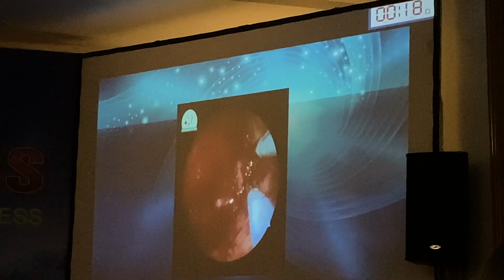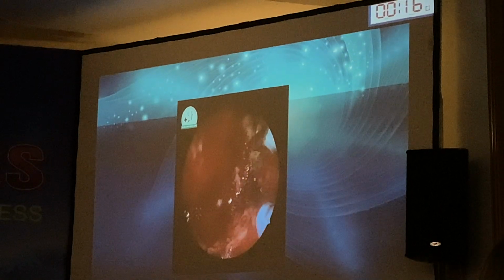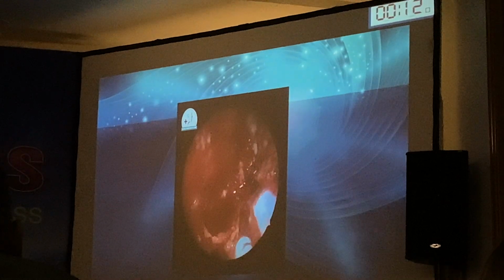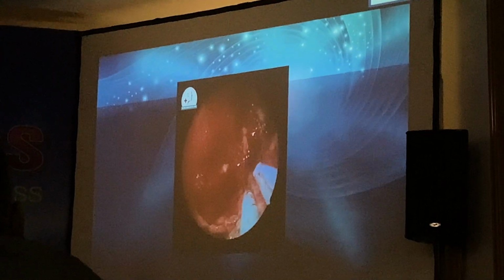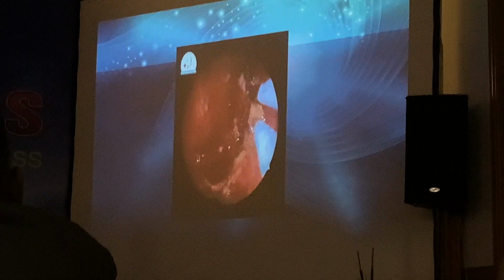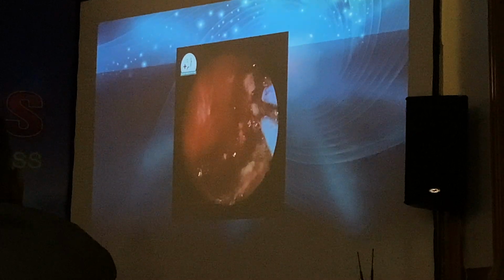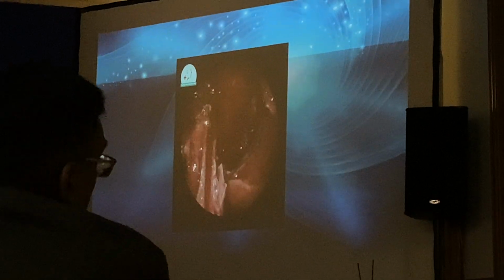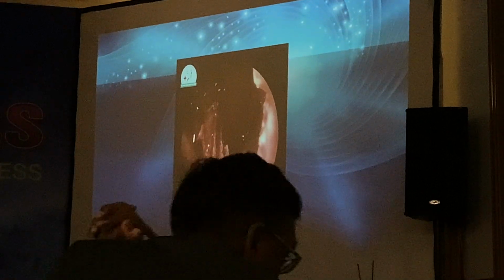So bipolar at the periorbita. And this is the final look.